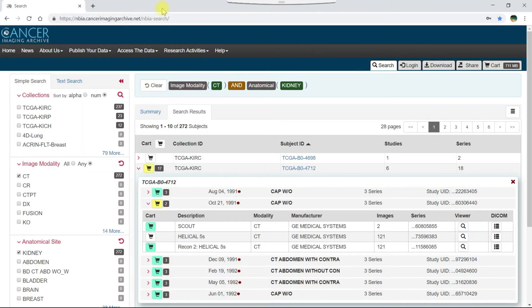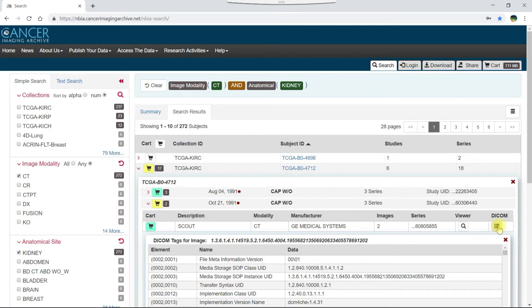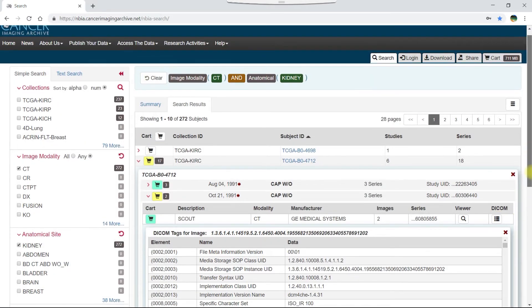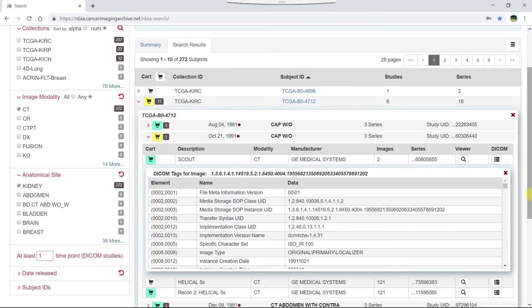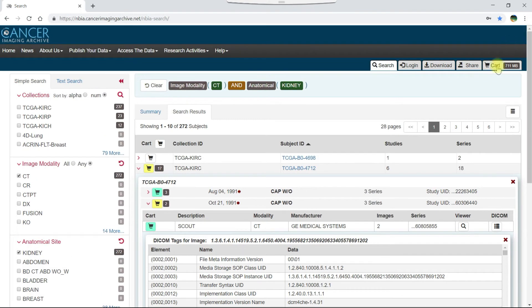You can also click the DICOM button to display details from the metadata in the image header. Let's end by clicking the cart tab to see what data we've added to it.